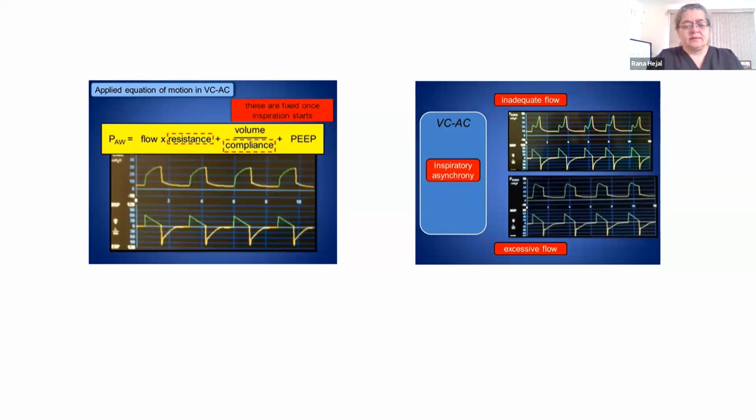The faster the flow of gas, the shorter the inspiratory time, the longer time they have to exhale. And that's what they are used to. So if you don't pay attention to that, and you give them a regular flow rate for anybody, like 40 liters per minute, you will end up with somewhat of an air hunger, and you will see them working hard and scooping this waveform.